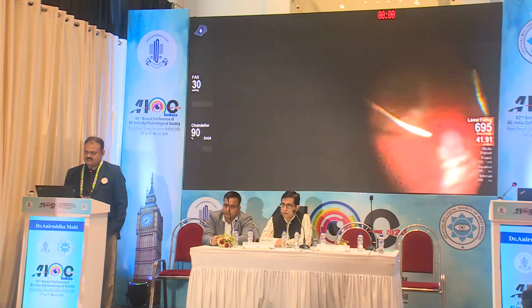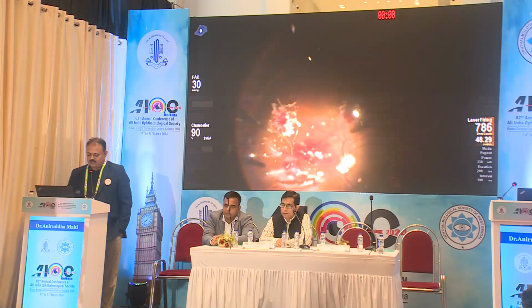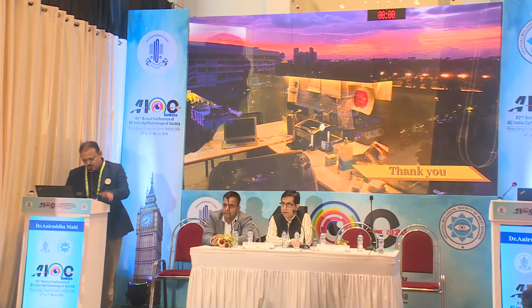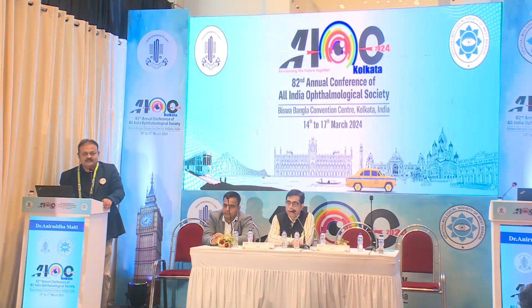Now things become easier. Combined art. So these are the following few tips which we can follow and prevent any iatrogenic complications.